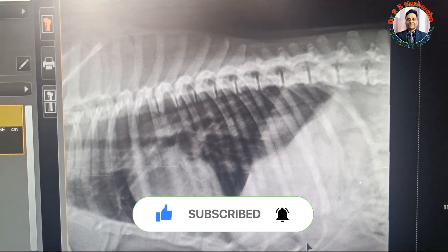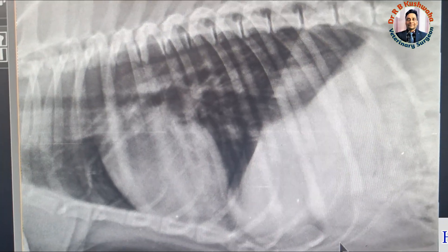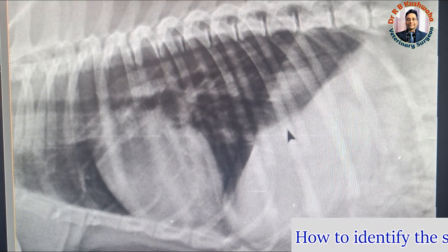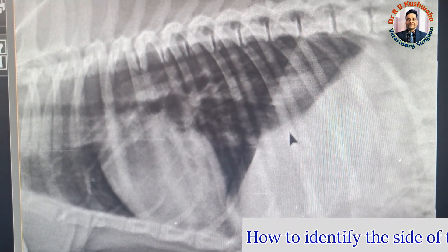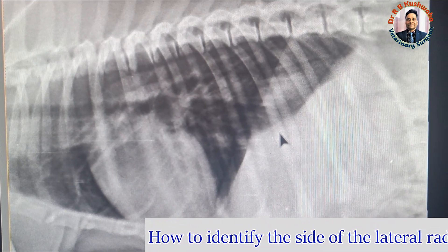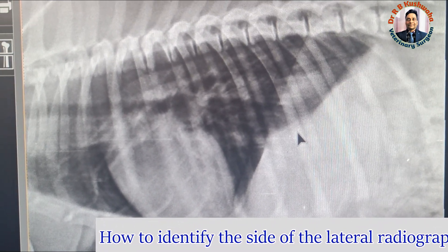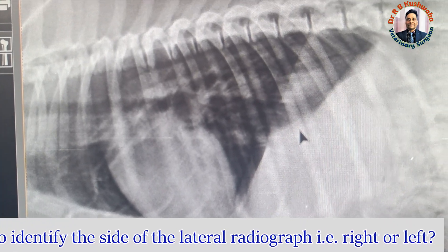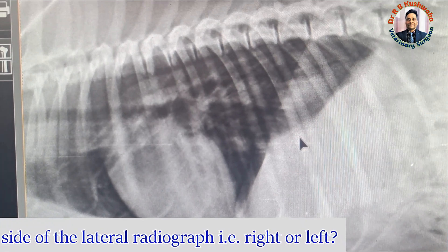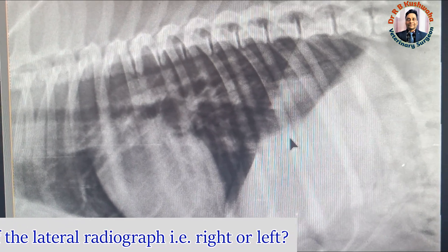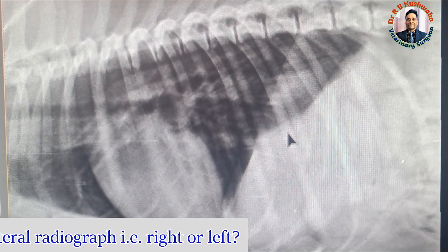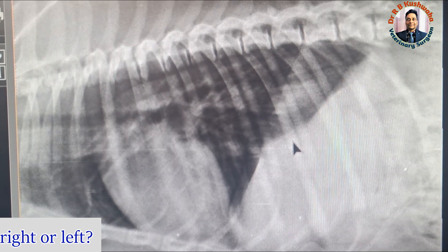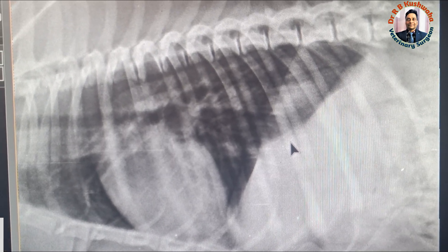Today I am going to tell you how we identify the side of a radiograph taken in lateral recumbency. If a radiographer forgets to mention the side, how do you identify whether that particular radiograph was taken in right lateral recumbency or left lateral recumbency?